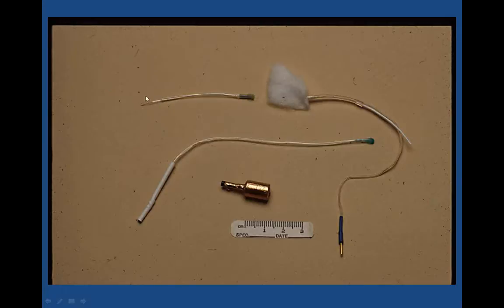All it took was buying some wires, some elastic tubing, and getting a little cotton plug or foam plug and constructing it that way. And it still works pretty well, and it's certainly an economical way to do it. But I would say for the last 4 or 5 years, we have been using the commercially available tympanic membrane electrode that was originally produced by Biologic, but now, as I'll show you on the next slide, we're ordering them from Sanibel because they've taken over the manufacture of these things. I'm not aware of any other company that's manufacturing the commercially available TM electrode.